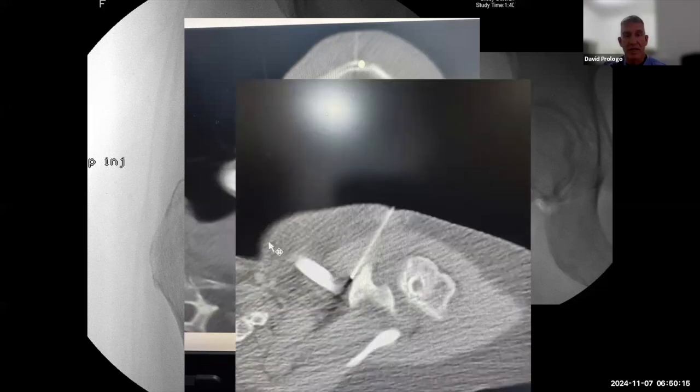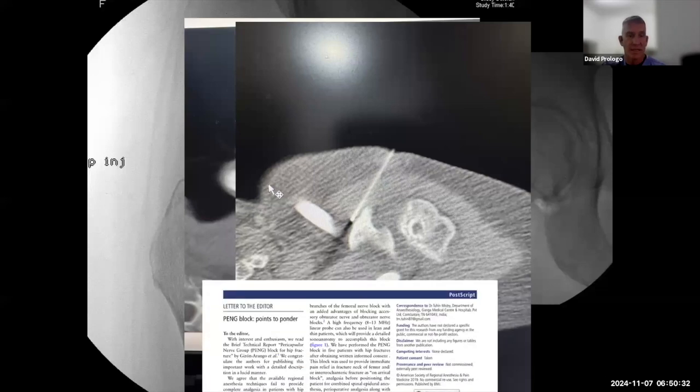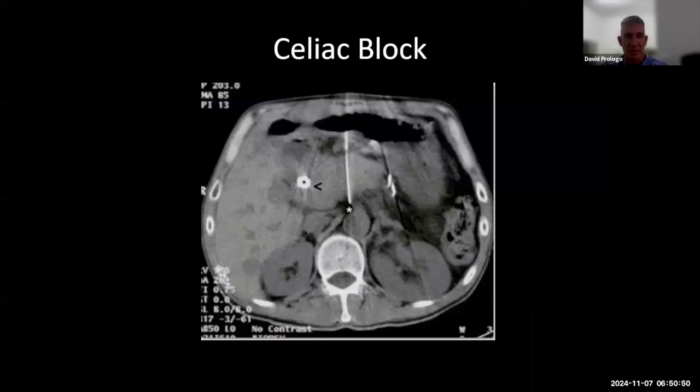And just this morning, we did exactly that in a patient who had asymmetric advanced osteoarthritic change in her left shoulder. We used CT guidance to access branches of the suprascapular nerve and axillary nerve for purposes of injection this morning, but we can also ablate. And on it goes, right? The other option around the hip now is something called a PENG block, which allows us to use CT guidance to access a fascial plane. But the point is that in that bottom left box are a lot of potential procedures for us.